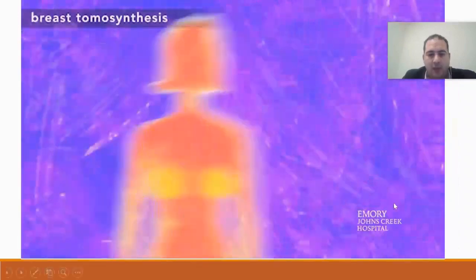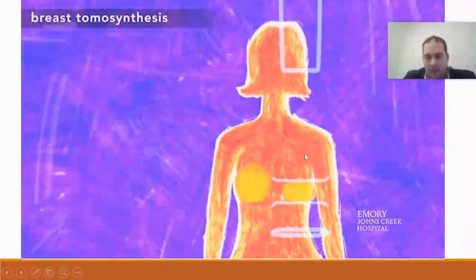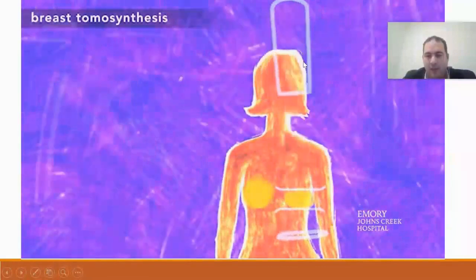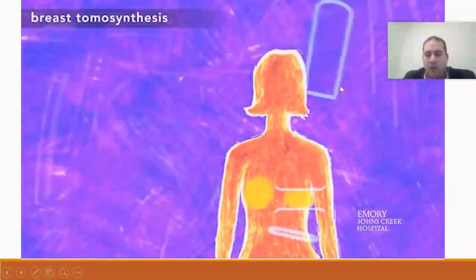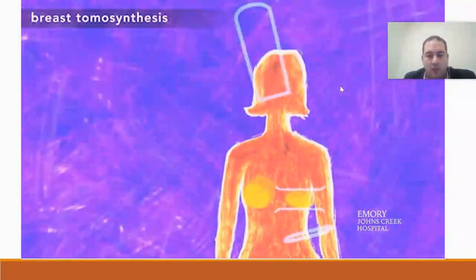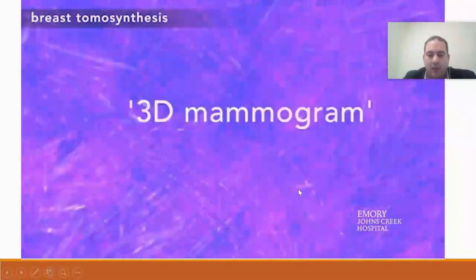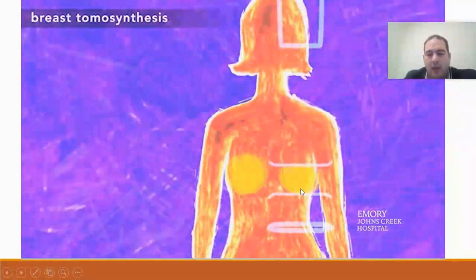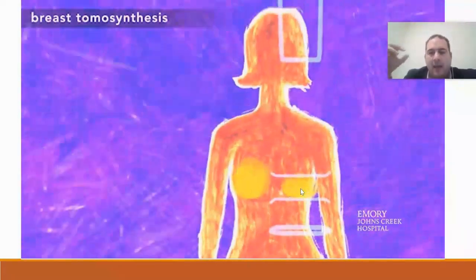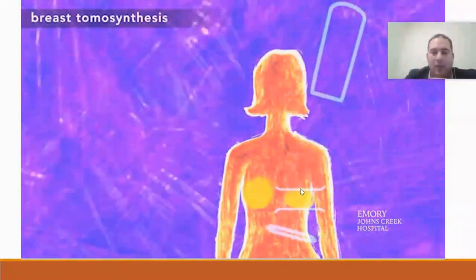The whole idea, as we mentioned, is that in the imaging process itself, I start by taking angles in the regular projection. Here is the detector, and here is the X-ray. You have two options. Either the X-ray tube moves with the detector, or the detector remains stationary while the X-ray tube moves. This obviously changes the shape of the image itself. Because when you move in this way, for example, if you fix the detector, it's like taking the image obliquely as opposed to both moving at the same angle. You would have taken an image of the same area, but at a different angle.